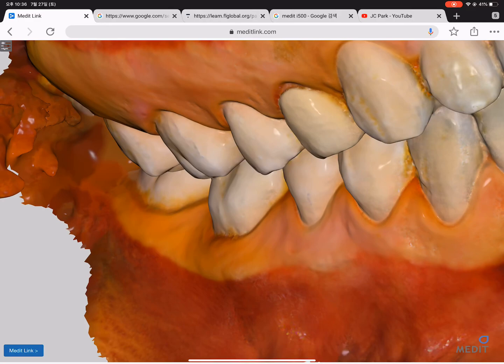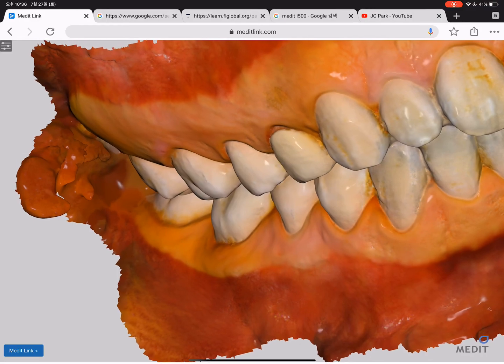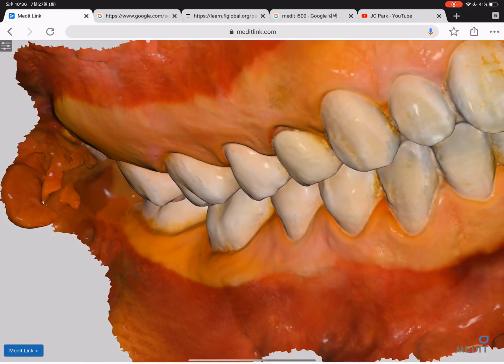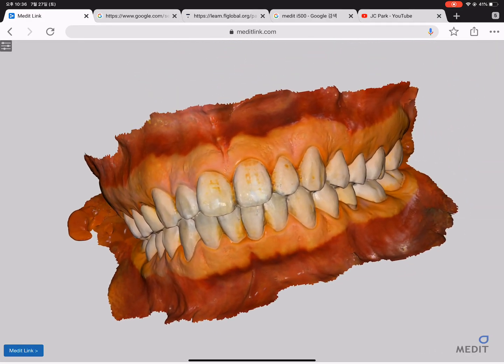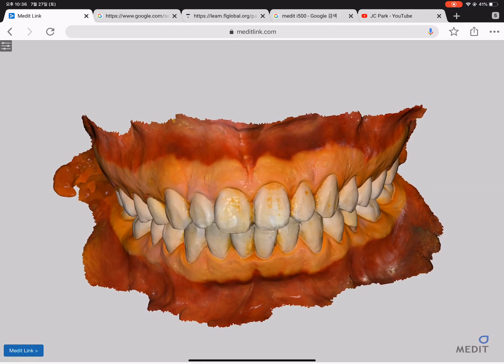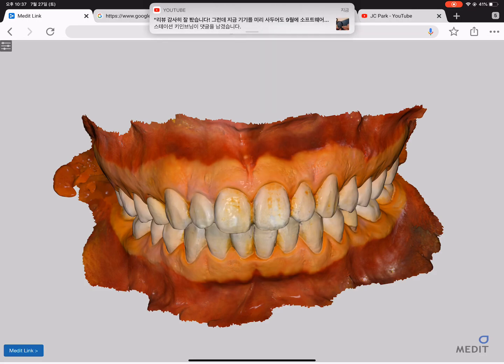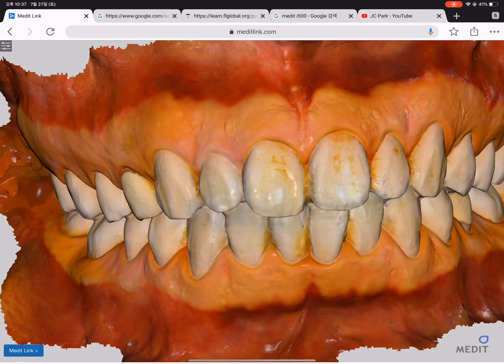Using this digital scanner technique, we can automatically measure the true distance from the gingival margin to the mucogingival junction, and we can also measure the area of the keratinized tissue. This is a very dramatic improvement of the measurement technique, and we are currently conducting a clinical study enrolling patients with a healthy periodontium in their 20s, measuring the whole keratinized tissue and attached gingiva around the tooth.